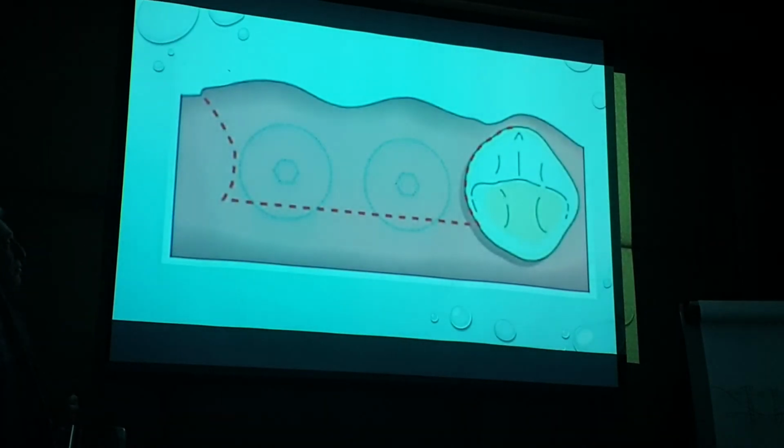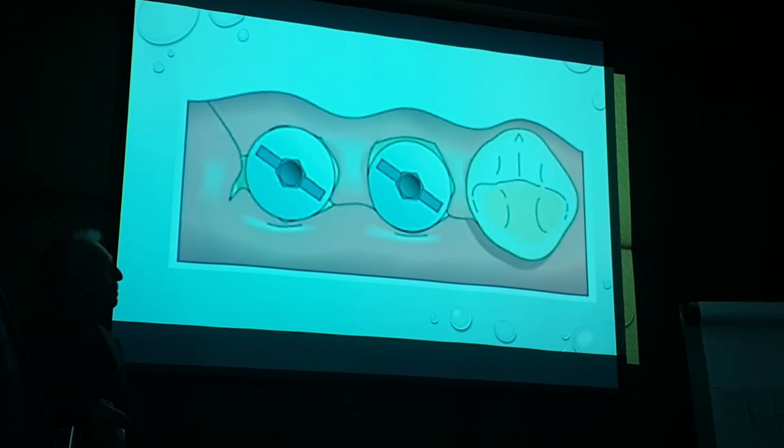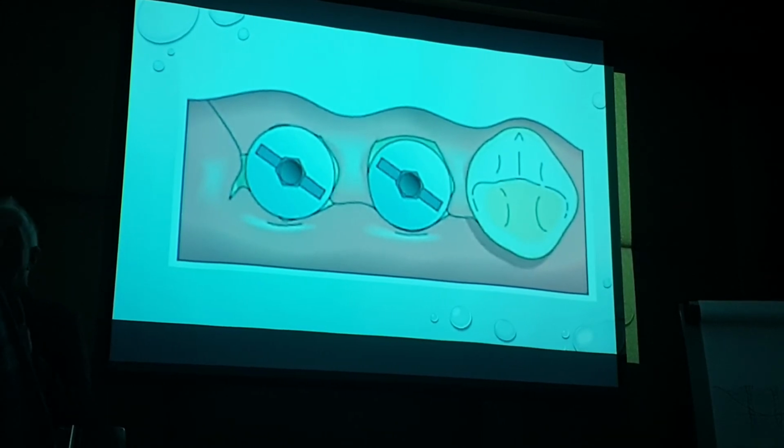Papilla regeneration with flaps. This is called the Palacci flap. Anyone here know that term? Where instead of making a crestal incision to expose our implants, we'll make it more on the lingual and palatal side. We will extend that flap to the facial. Then we'll take a little bit of a cut here, a little bit of a cut here, and then rotate that tissue to go in proximally. That's for people who don't use PRF.